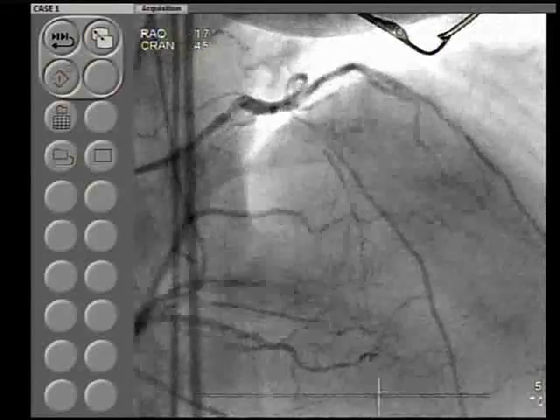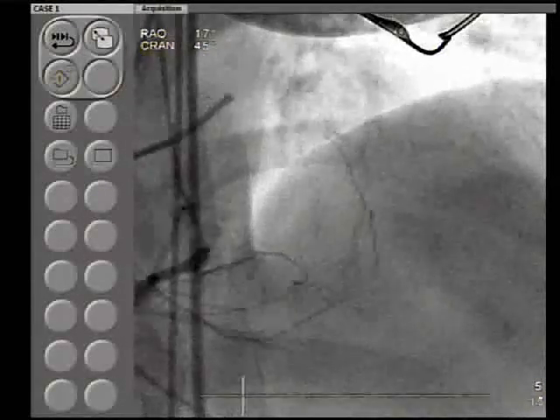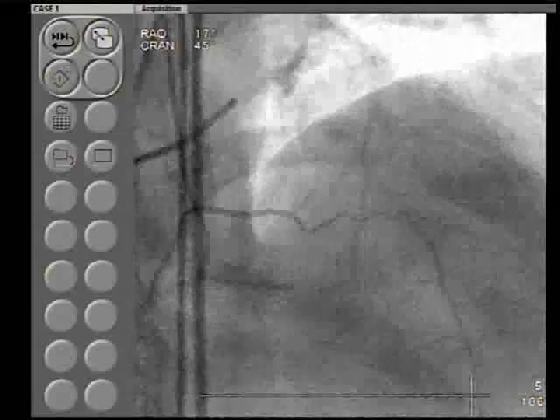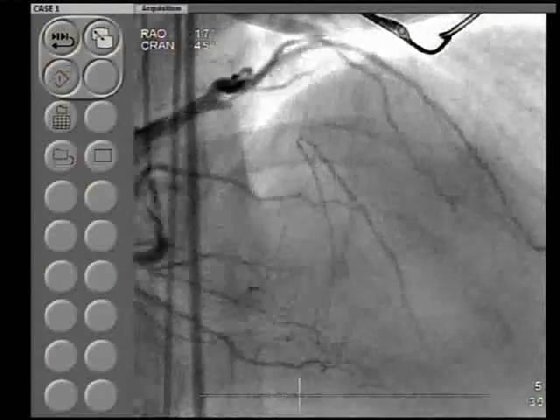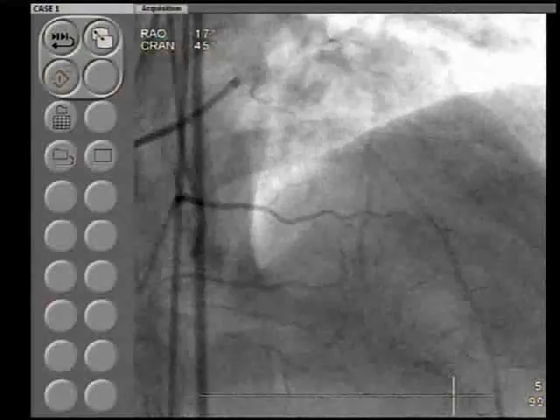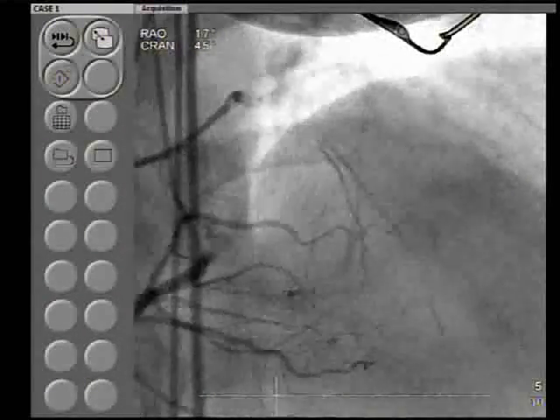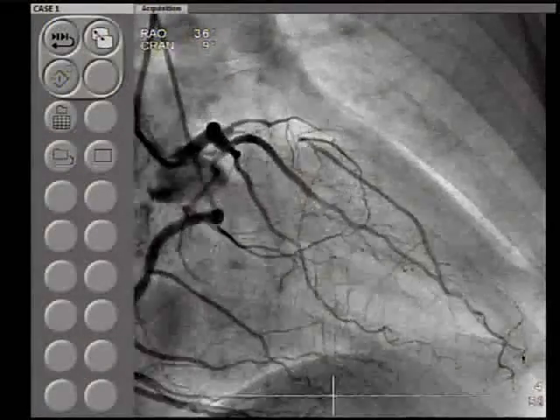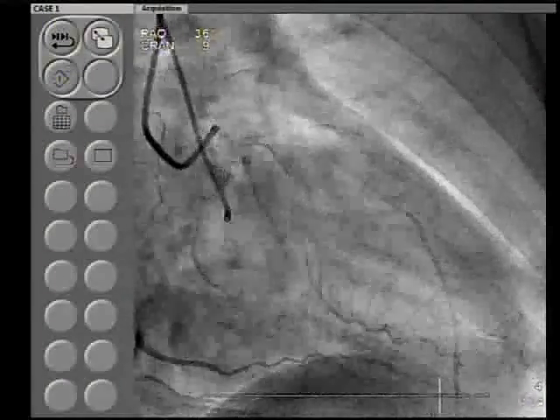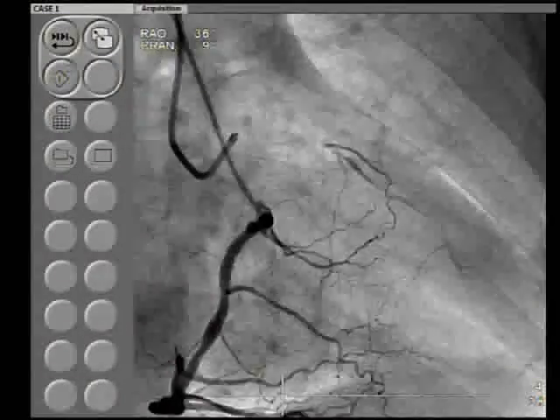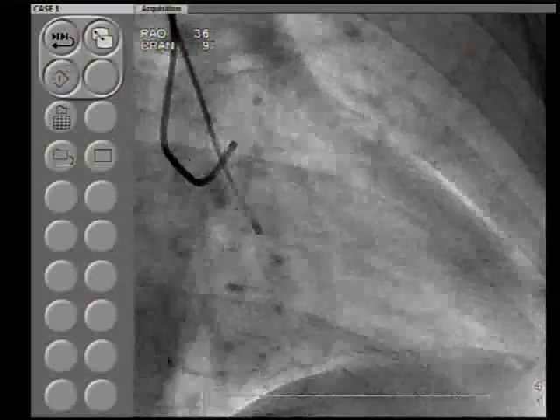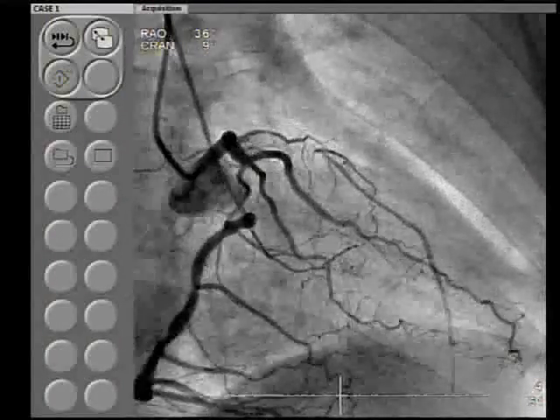In the current era, the traditional adverse characteristics of CTOs have somewhat evolved. In the SYNTAX scoring, the length of the segment still remains important, along with whether there is a side branch originating at the lesion, taper versus blunt stump, and calcification. We have done the SYNTAX score on this patient and it is 22. The only thing not present is a bridge collateral. Otherwise, everything is adverse — there is a side branch and calcification with nicely calcific edges.